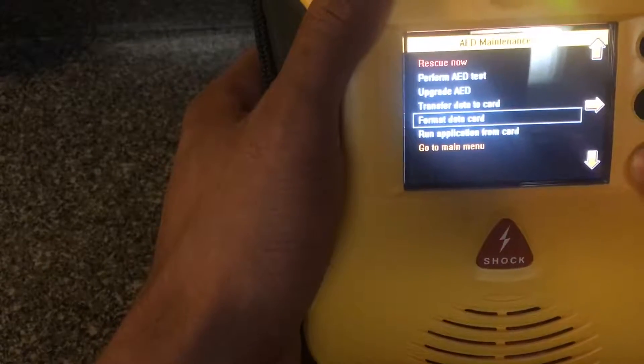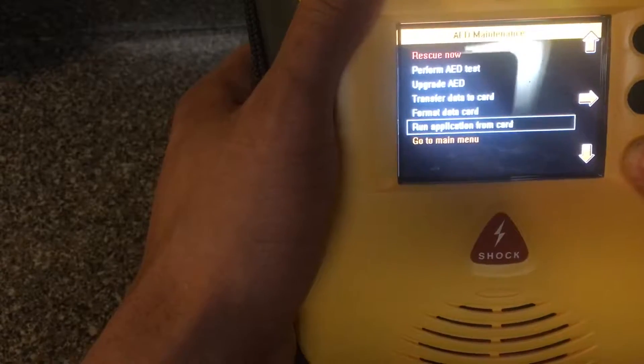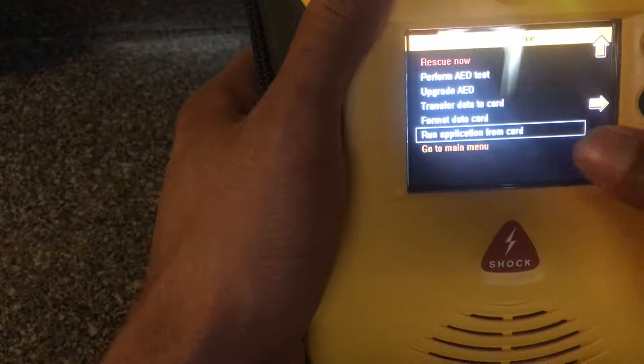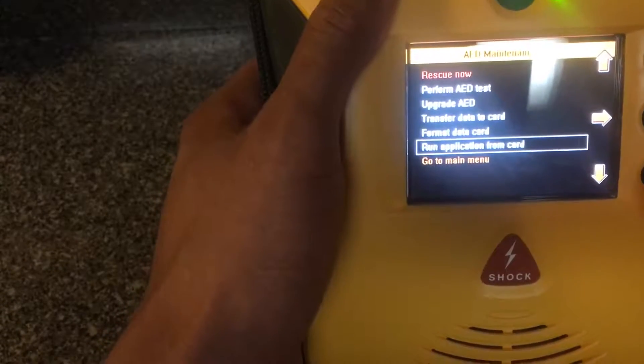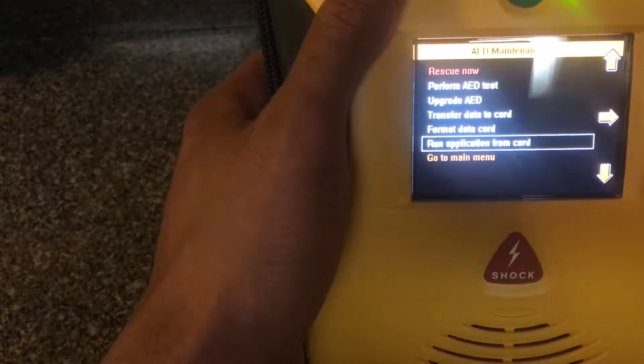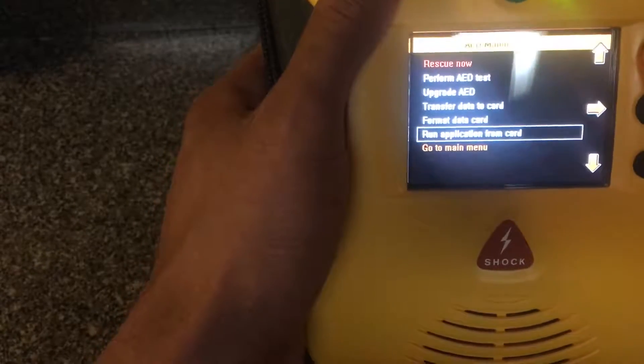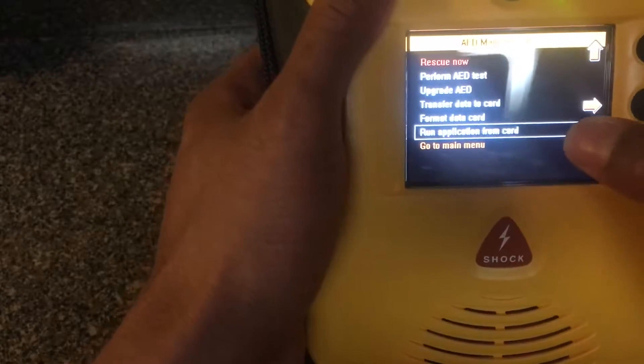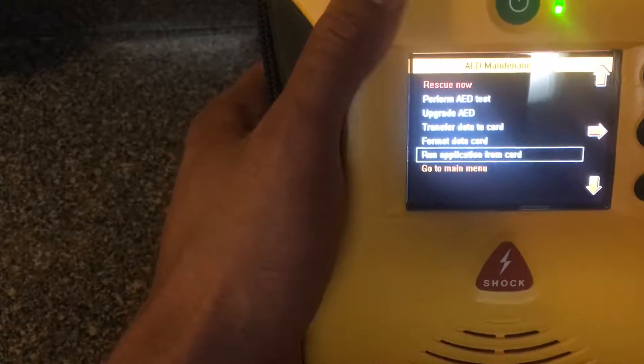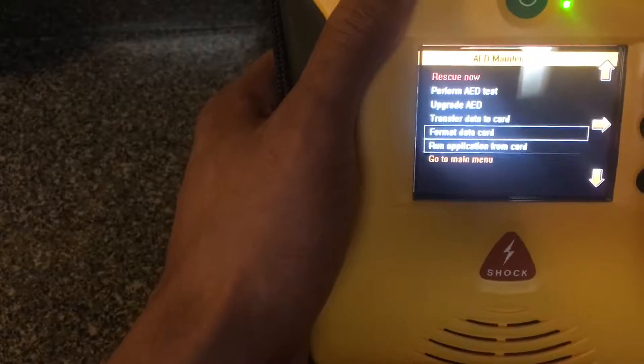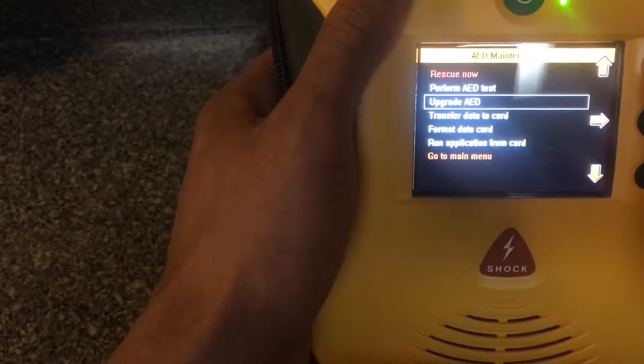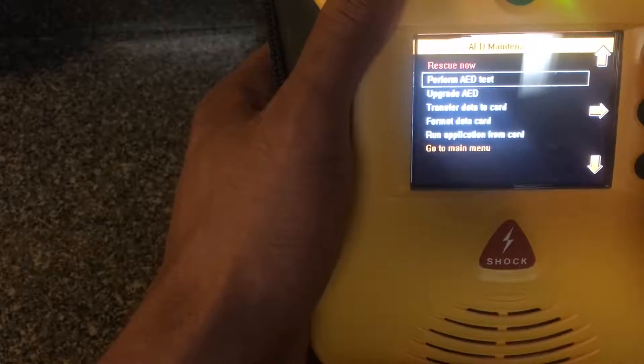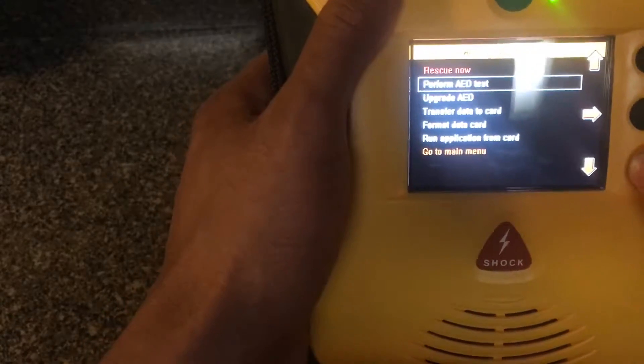Then you run application from card. Let's say, for instance, you have some information on the card like an update or something. You take the card and then you run application from card, and that should update your defibrillator.